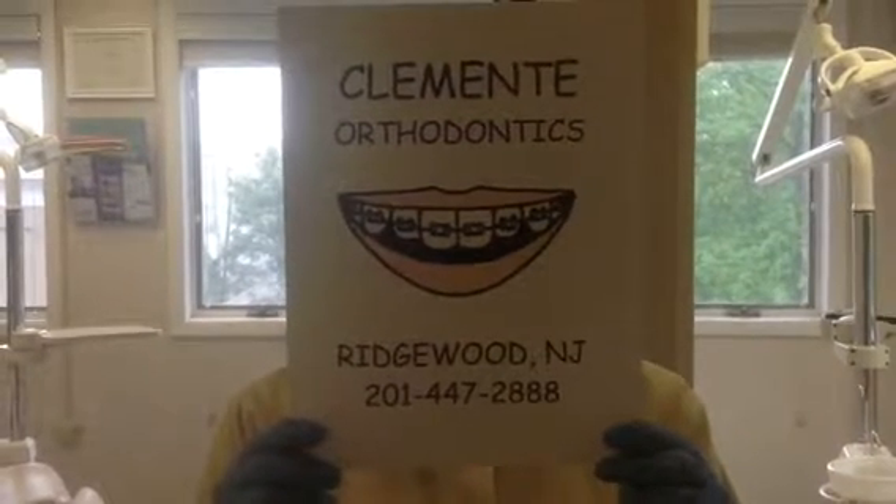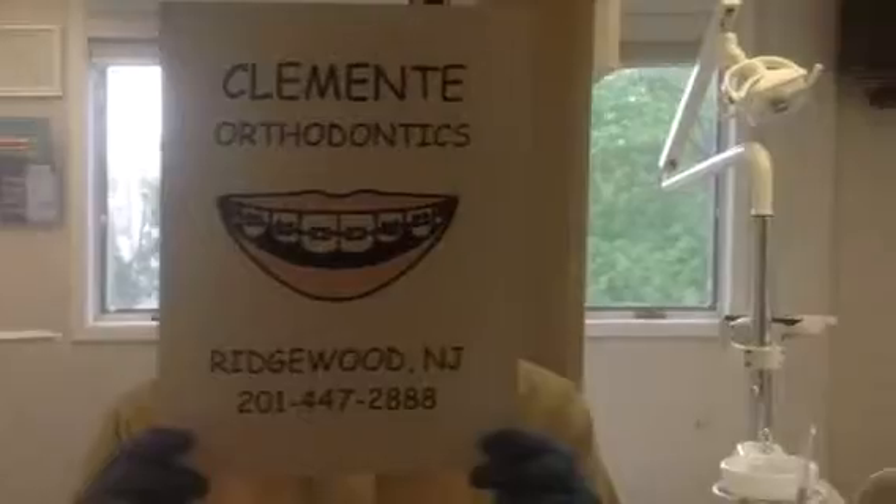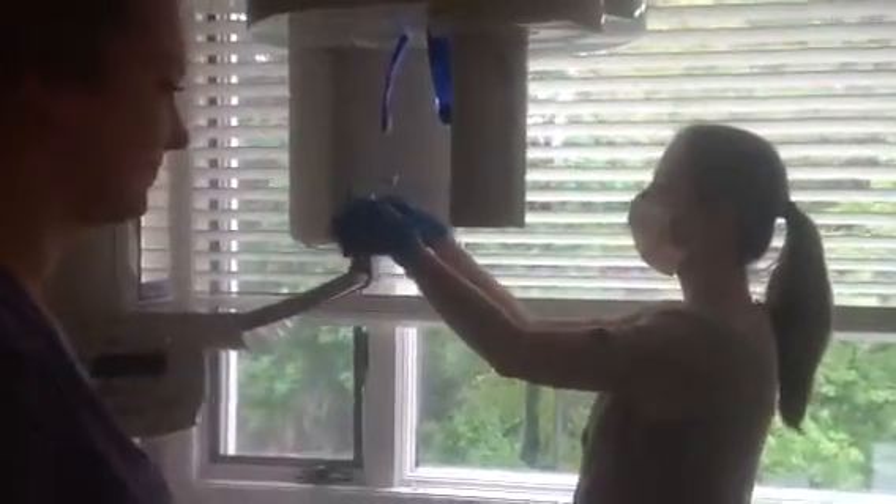Hey, it's Eva again from Clementi Orthodontics, and we are going to show you how we take a digital panoramic x-ray on a patient. On every patient, we put on a lead apron to protect our patients from any radiation.